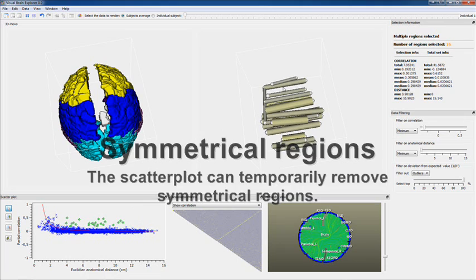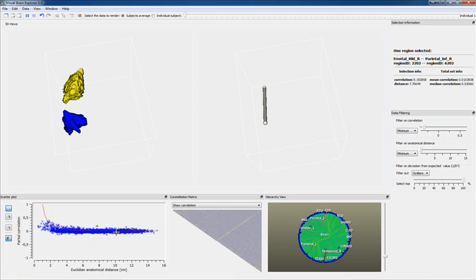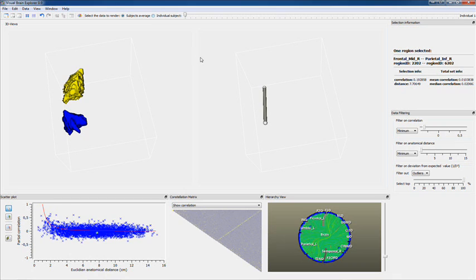So these are all symmetrical regions, and you might not be very interested in them. For the moment, you can put them away. Now you see that the outliers aren't without these symmetrical regions. Let's put them back on.